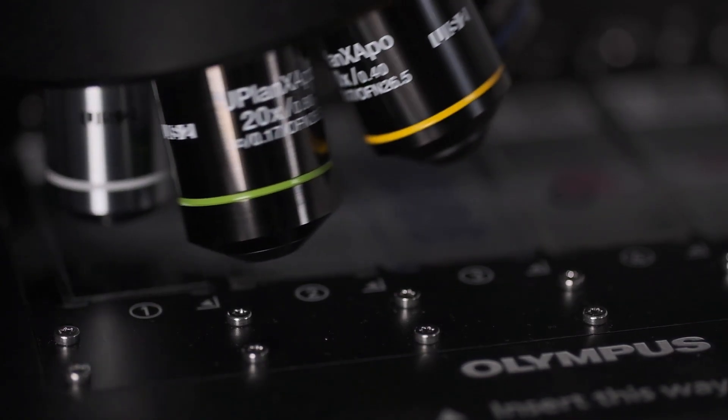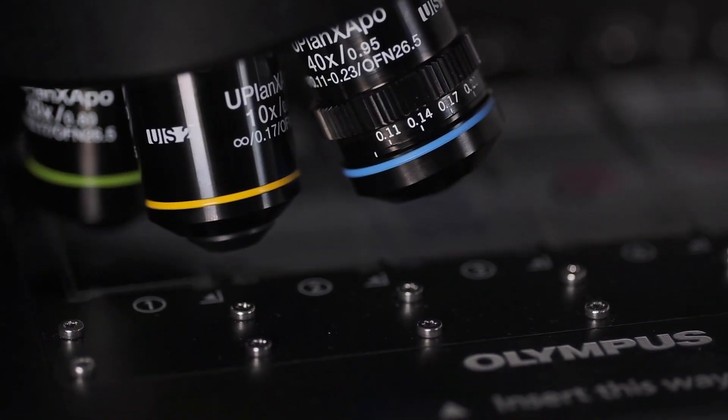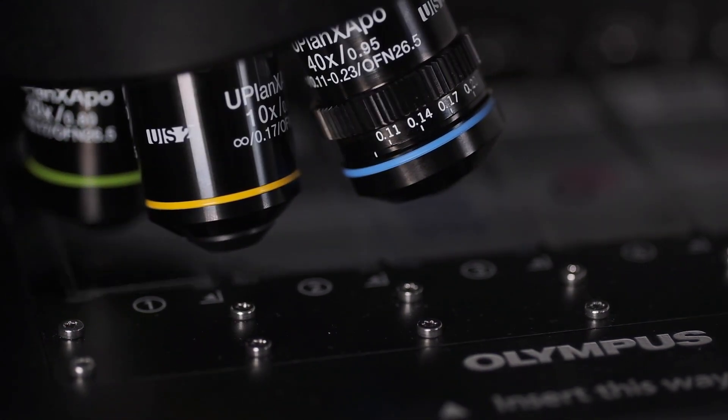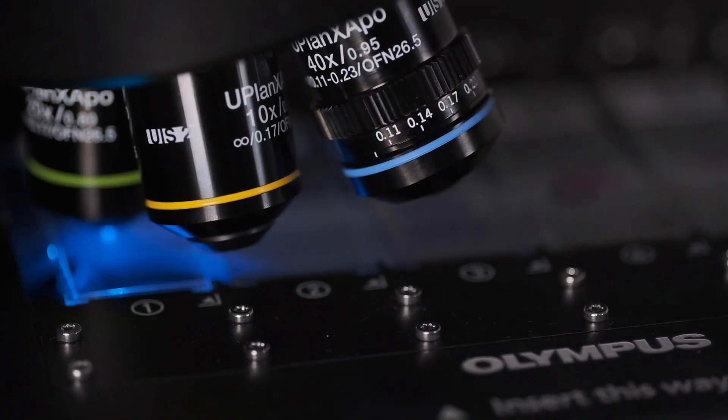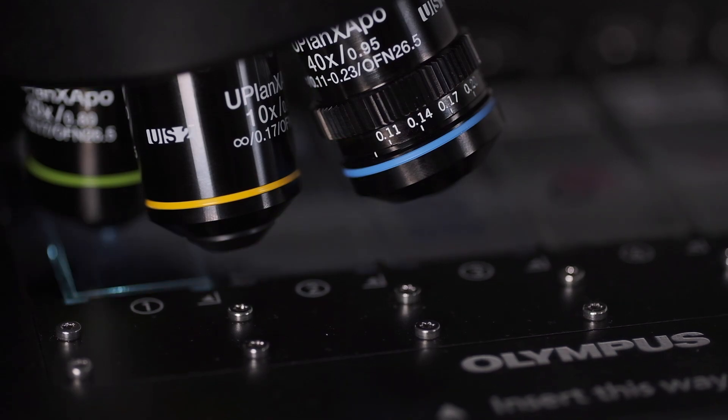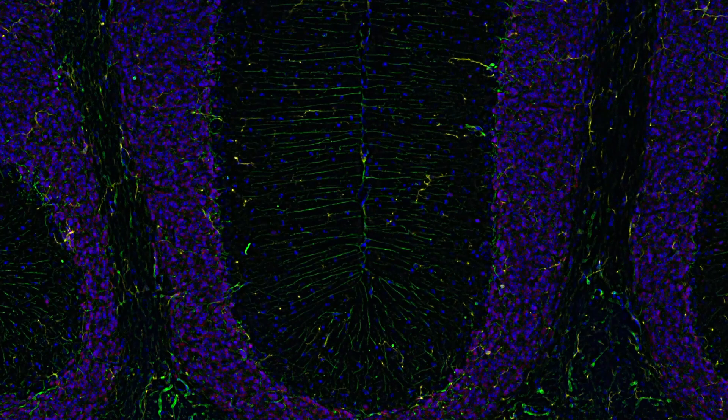With leading-edge optics and innovative features, the VS-200 slide scanner improves experiment data quality and workflow for many applications.